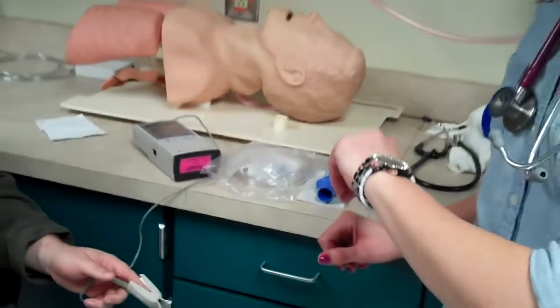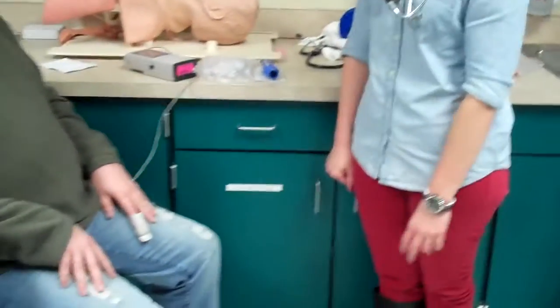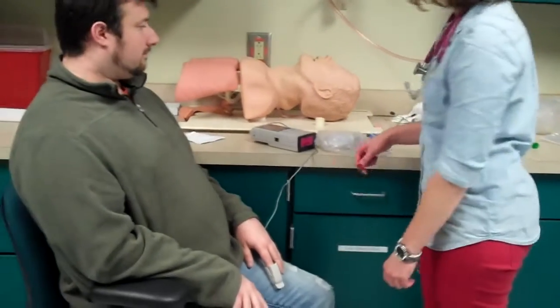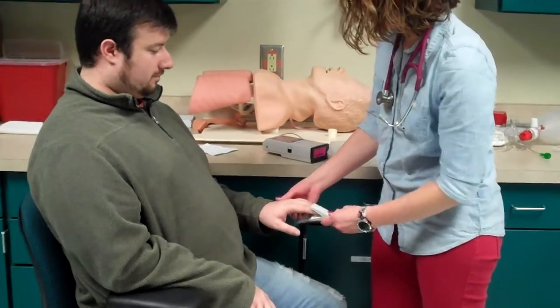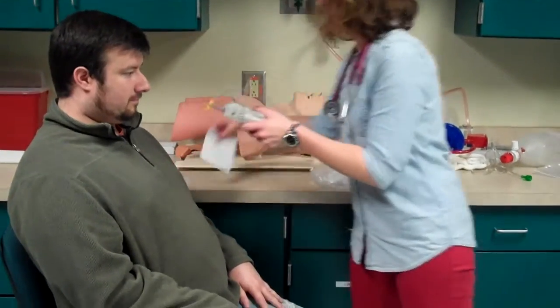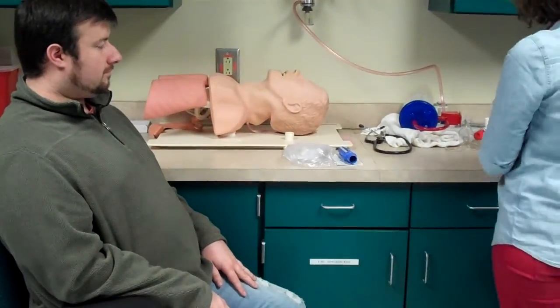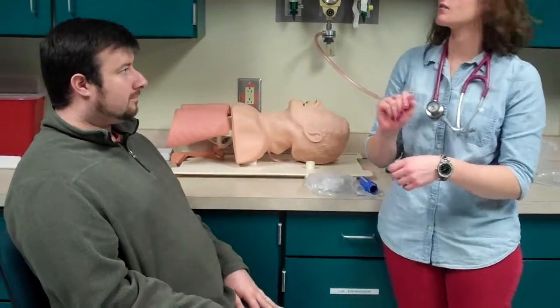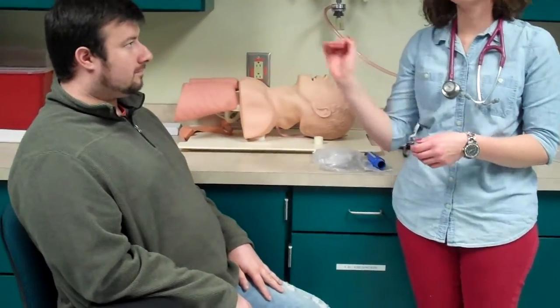Okay. And what number did you get, beats per minute? 80. So you counted how many in 15 seconds? 20. And so his breath sounds were some slight wheezes with a little bit of crackles. His saturation was what? It was 95. And his respirations were? His respirations were 12. Okay.